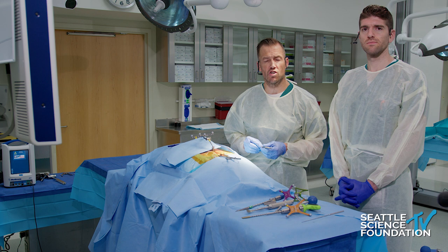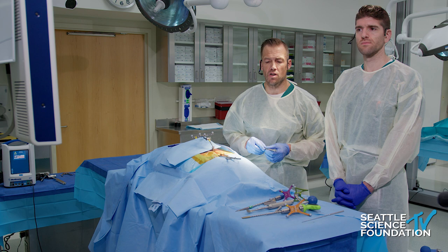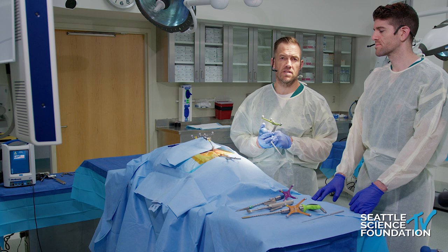After demonstrating the stacked granite, we'll quickly discuss some of the other devices available that affect fusion and stability across the SI joint. We have all our standard tools with reference arrays so we're able to use them with the Stealth technology. I'm going to start with the more distal screw.